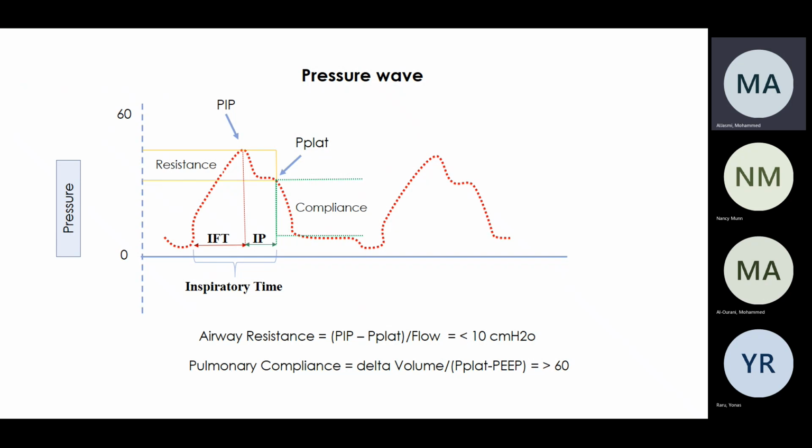So when I come to my patient, I know how to calculate the plateau. How do I calculate the plateau, Katie? Plateau pressure. Good. How many minutes do you need to hold? Okay, good. So how many seconds do you need to hold? That's right. 3 seconds is more than enough. With 3 seconds, you can get your plateau pressure, okay?